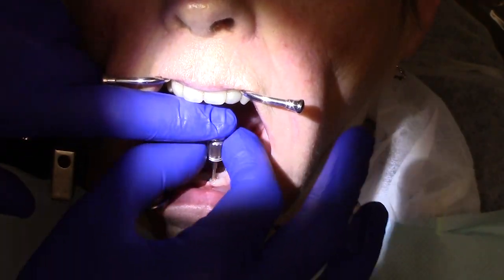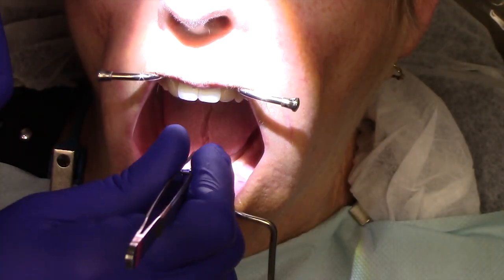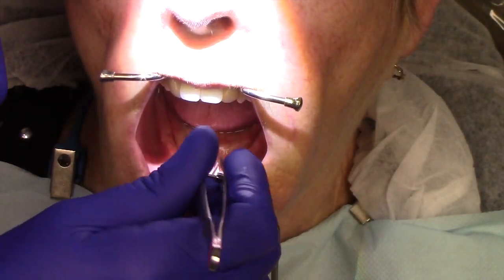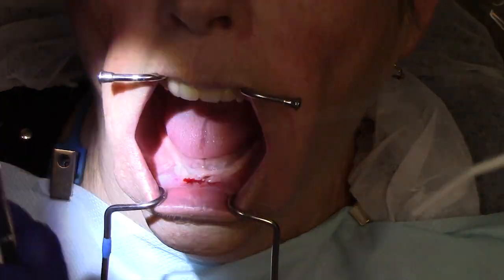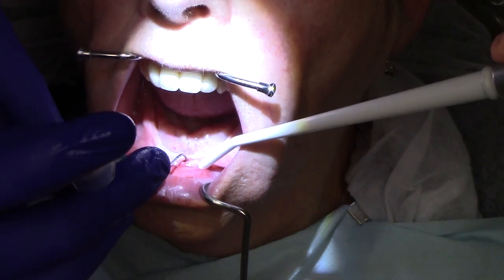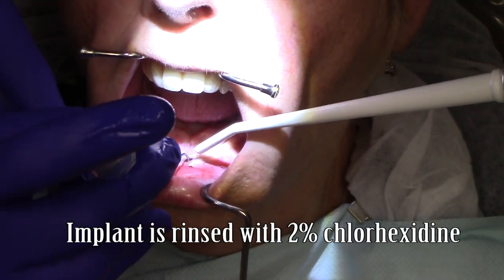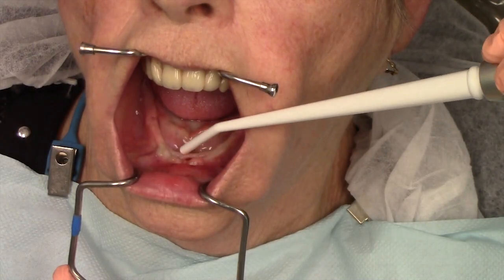I'm using a standard 0.050 inch hex driver to carefully remove the healing abutments on top of each of the implants. While no local anesthetic was used, a small amount of topical was placed. A periodontal probe is utilized to measure the distance from the top of the implant to the top of the tissue, known as the tissue cuff height. Additionally, I rinse with chlorhexidine.